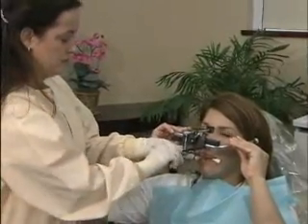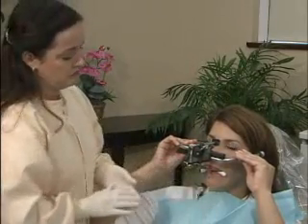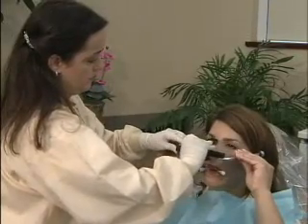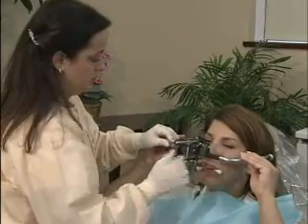Hold the joint piece in your left hand while tightening the T-screw of the joint piece with your right hand. Now that the record is complete, open the levers and slide the ear pieces out of the patient's ears, then gently remove the entire apparatus.